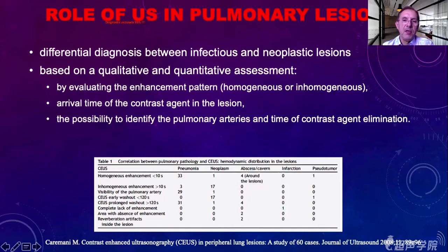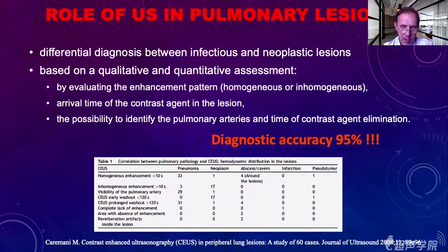Using that criterion in that paper, it was shown that diagnostic accuracy was 95%, so very high accuracy. Also, there are other parameters used to differentiate these two entities.